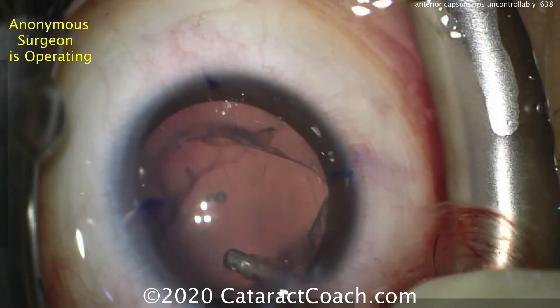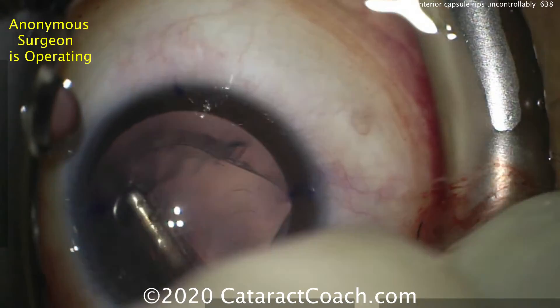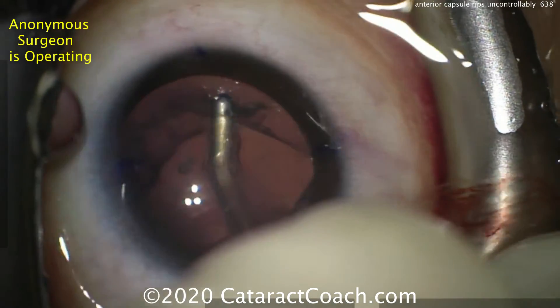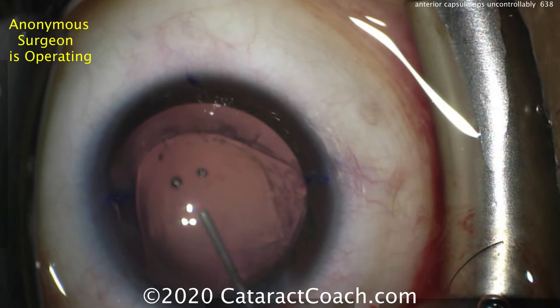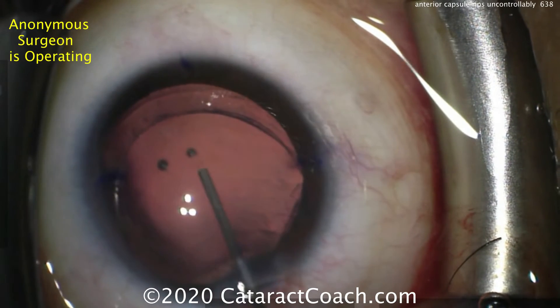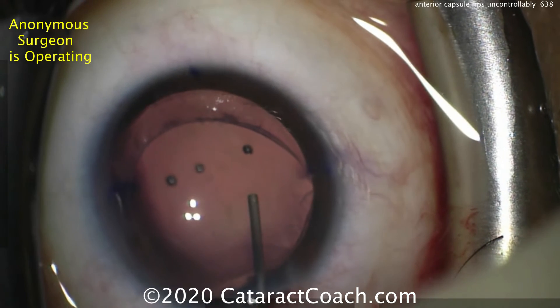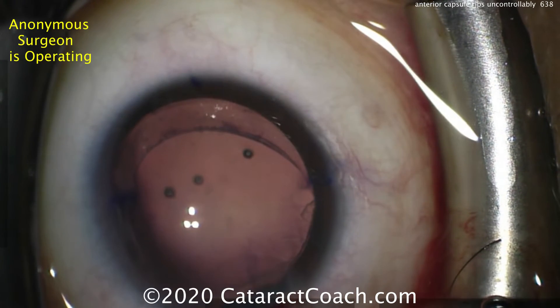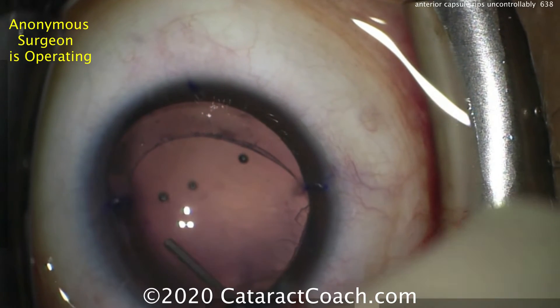So cleaning up the capsule, removing as much of the lens material as possible, and then trying to preserve the remainder of the capsule. Here's the viscoelastic. Now you can see very much the outline of what happened when that anterior capsule ripped uncontrollably. This looks pretty good — the posterior capsule is still intact, and there'll be a good place to put that single-piece acrylic lens.